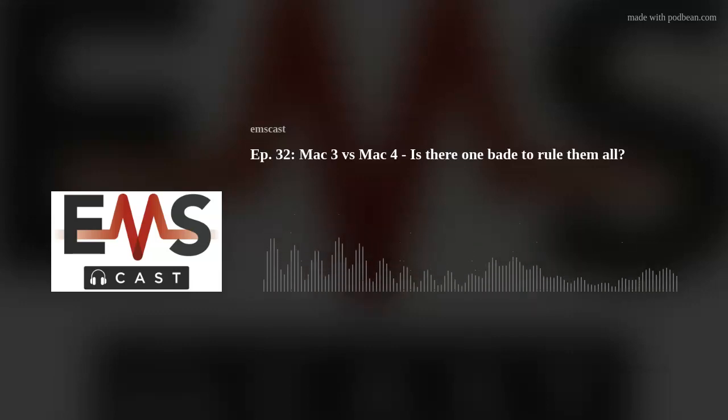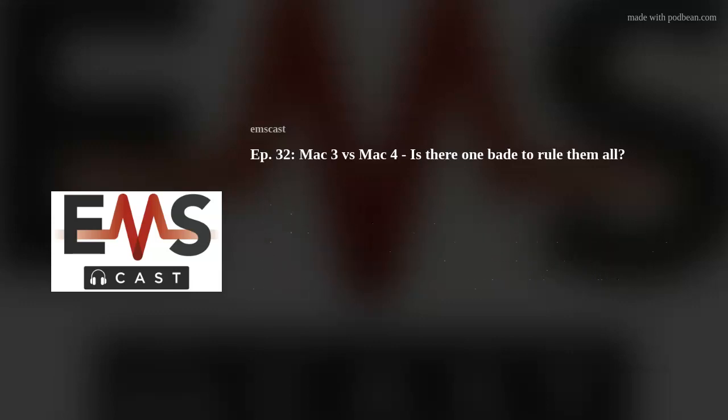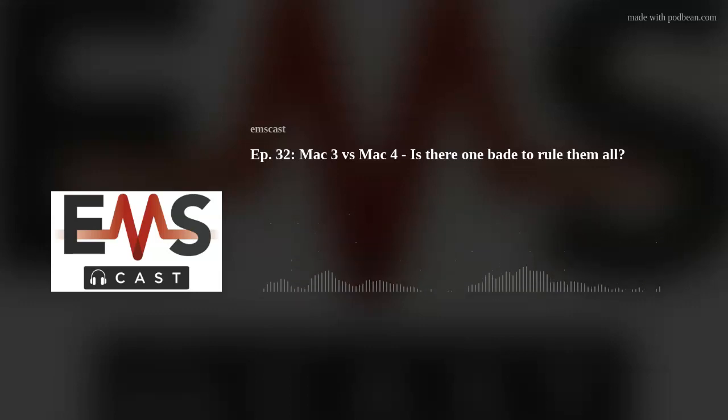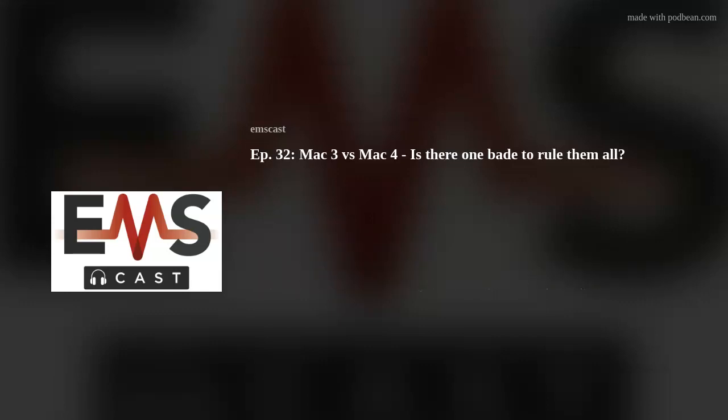Yeah, I think that you're right. The number 3 is probably better for most people. Give the listeners a little background about what our argument has always been. Well, what I was taught and what I believed dogmatically until this study came out was that the Mac 4 was big enough for everyone and would never be too small. That and then the extra length gave you like a better lever arm to lift with. And so the Mac 4, if you just use that on everyone, you never had to think about it and you were always going to be successful.